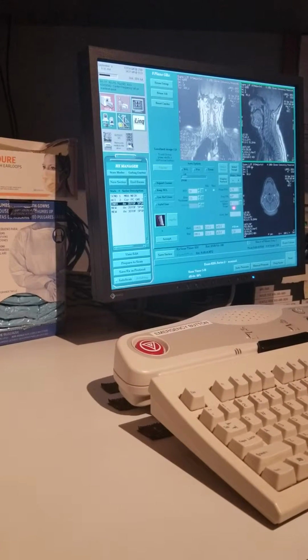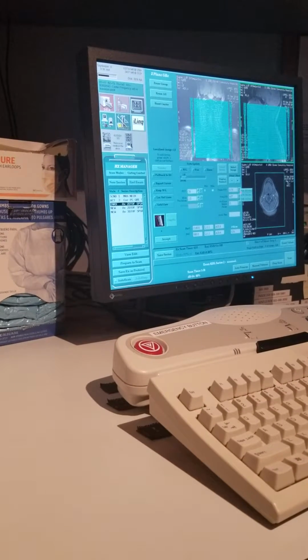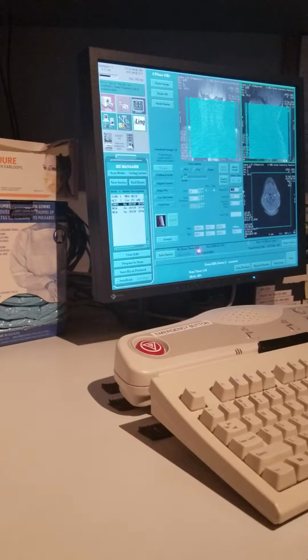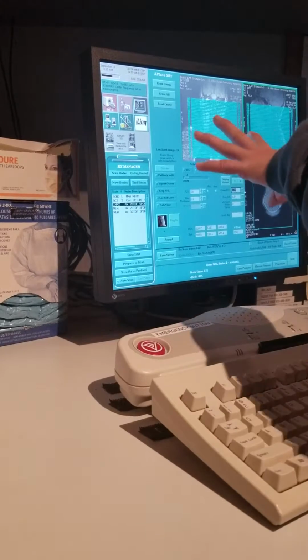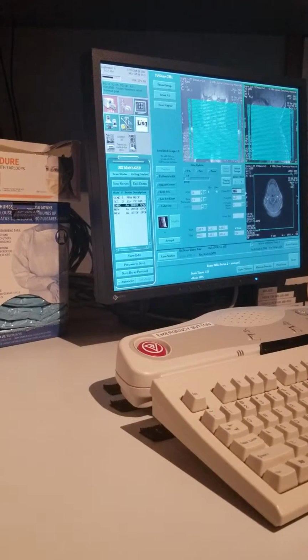Go into graphic and then change it to full phase field of view. And then watch what it is. So how much time do we say? You're going to do a lot of this when you're scanning in the real world, because you don't really need that much, right? You just have to know if you're going to get phase wrap.